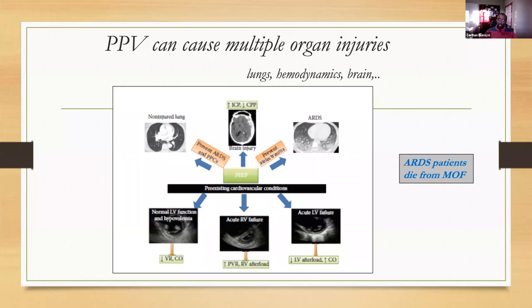So that injury slowly accumulates and will cause lung damage. Typically, the mistake we have made in the past is that when we put a patient on a ventilator, the goal we were setting was correcting the blood gases. Like, look at the SAT, we are happy. But we understand now that we are fooling ourselves, because by looking at saturations or anything like that, we are treating our own mind, not the patient.